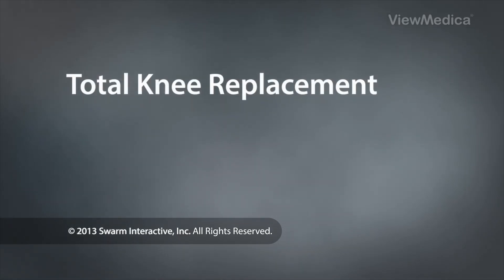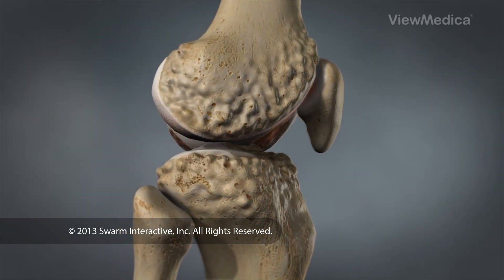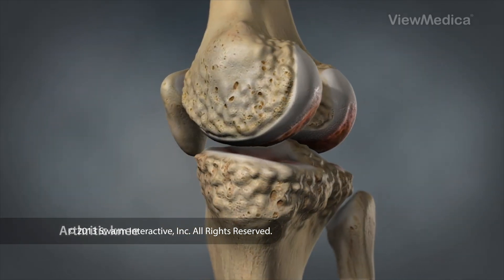Total knee replacement. This procedure restores function to a severely damaged knee. Most commonly it is used to repair a knee that has been damaged by arthritis.